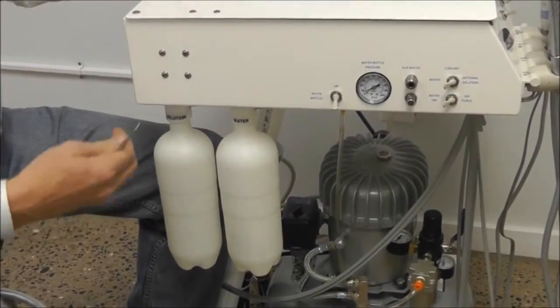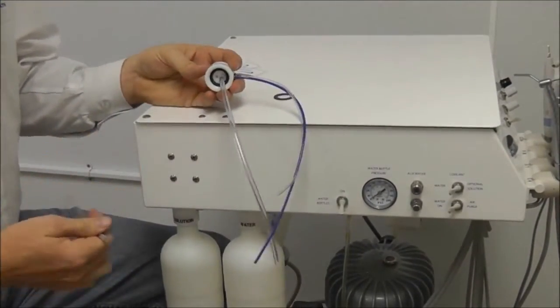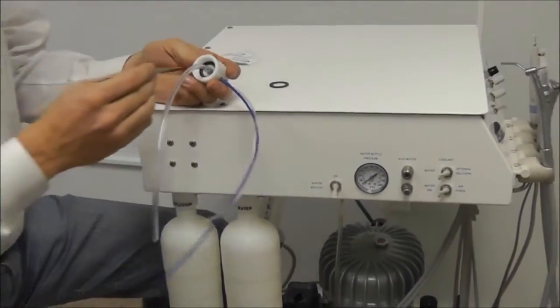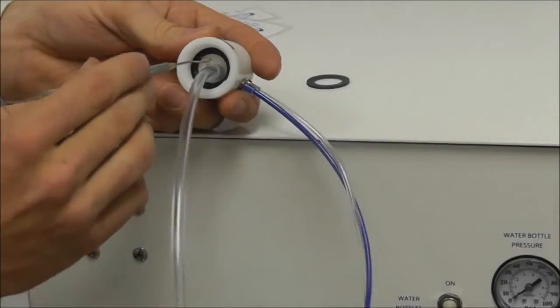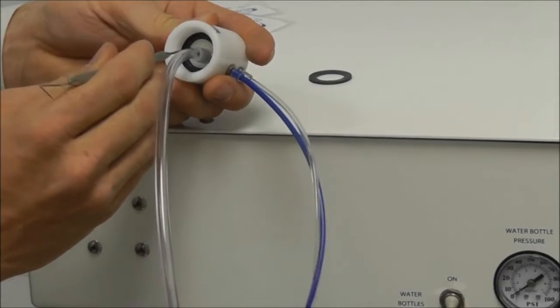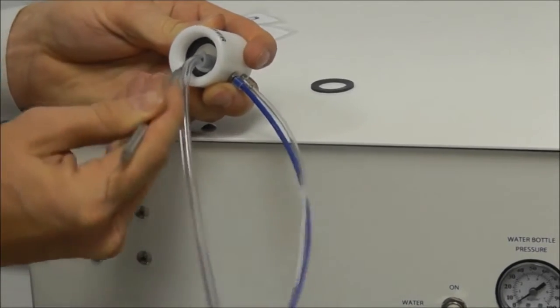Go ahead and we'll shut our pressure off to the water bottle. I do have a threaded water bottle hookup housing here, the same one that's on the cart, but for demonstration purposes we'll show you how we remove the used one out of this unit so that you can see. By using an Explorer, we're just going to reach underneath that gasket and start to loosen it.